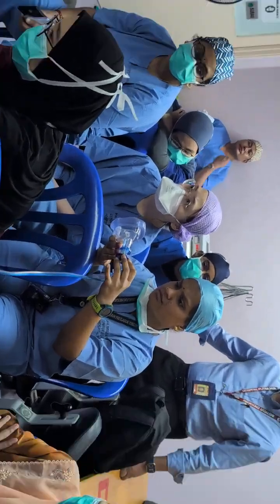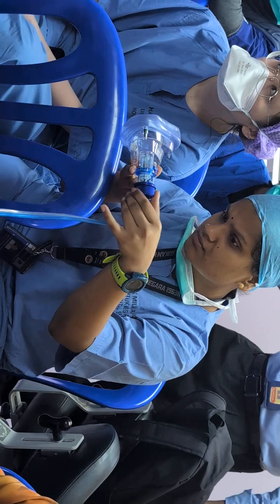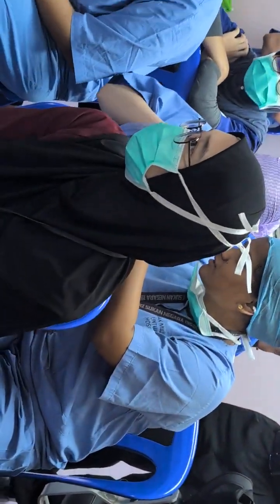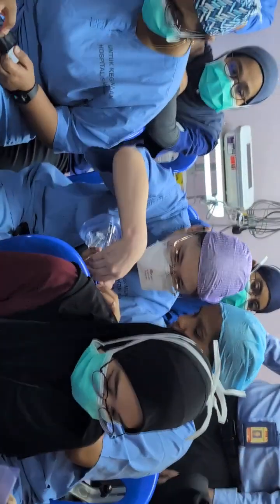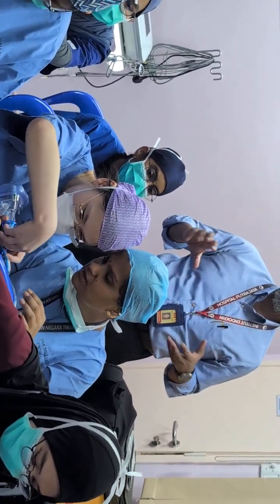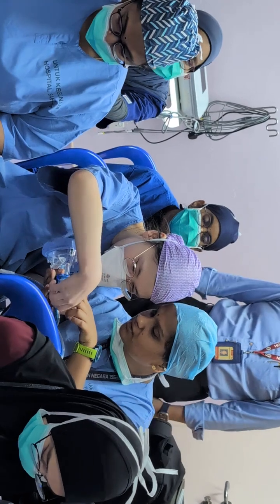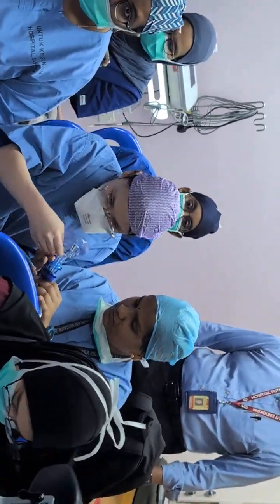Betul. So this one is mechanical, it's physics. You close one part of the valve, that increases the PEEP for the patient. That's right. If you remember 20 or 30 years ago, we had a big balloon for a PEEP, same principle. So we just put in oxygen inside there and then I'm going to show you the balloon, doctor. No, my one is a different kind of balloon.